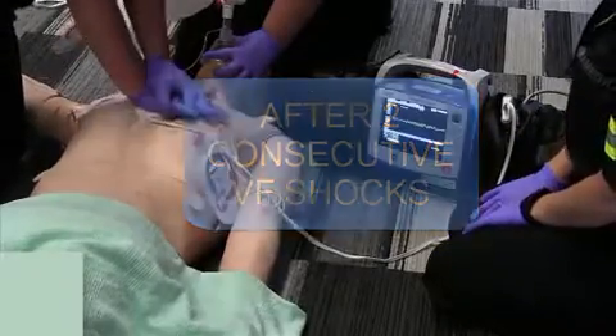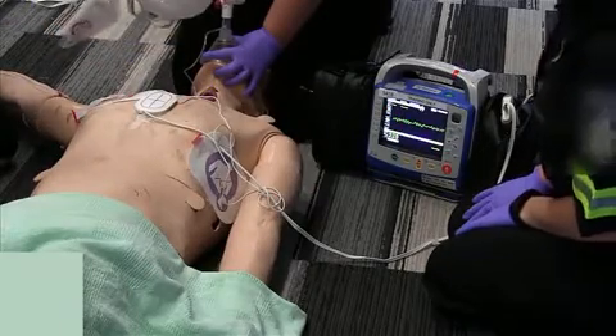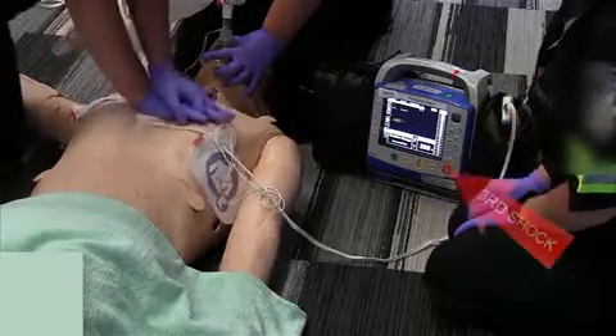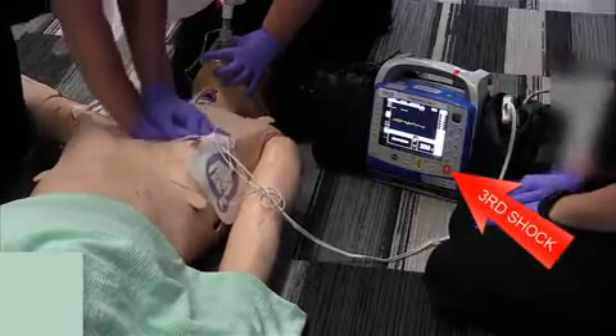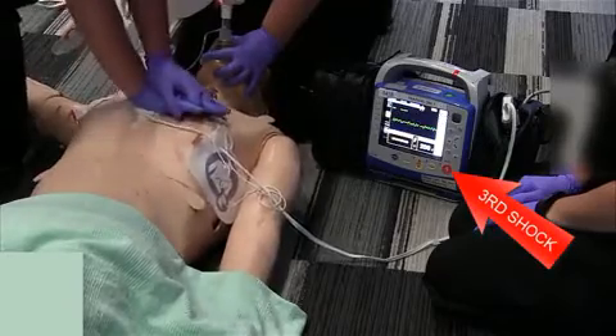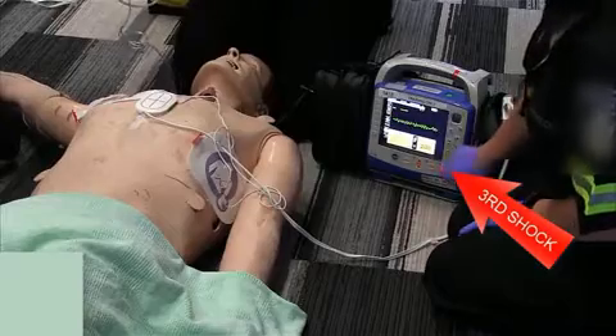26, 27, 28, 29, 30. Stop CPR. We're going to do our third rhythm analysis. Patient's still in VF. Back on the chest. We're charging. Okay, it's charged to 200. Everyone hands off. Shock delivered.